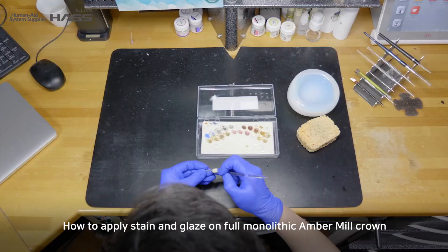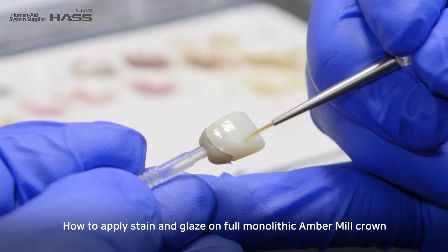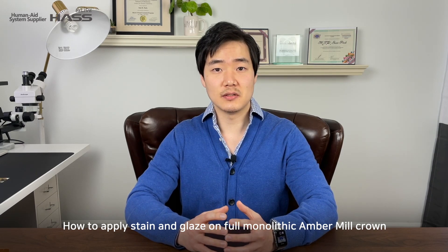Hello, ladies and gentlemen. My name is Sean Park. I'm a master's ceramist and a laboratory supervisor at Dr. Goldstein, Garber, and Salama in Atlanta, Georgia. Today I'm going to share how to apply stain and glaze technique on full monolithic Amber Mill crown, and the stain kit I'm going to use for the demonstration will be Noritake FC Paste Stain.